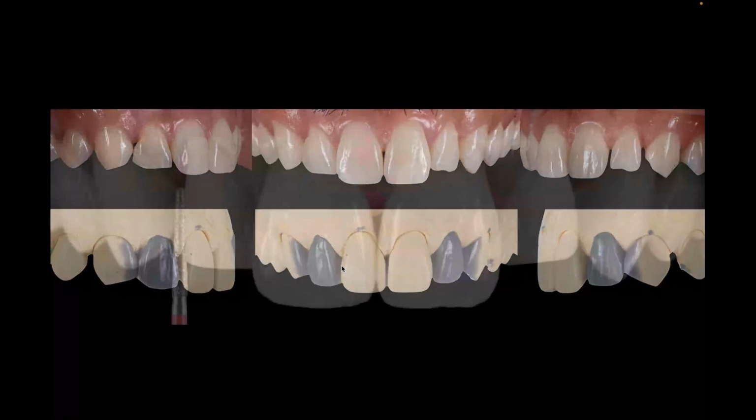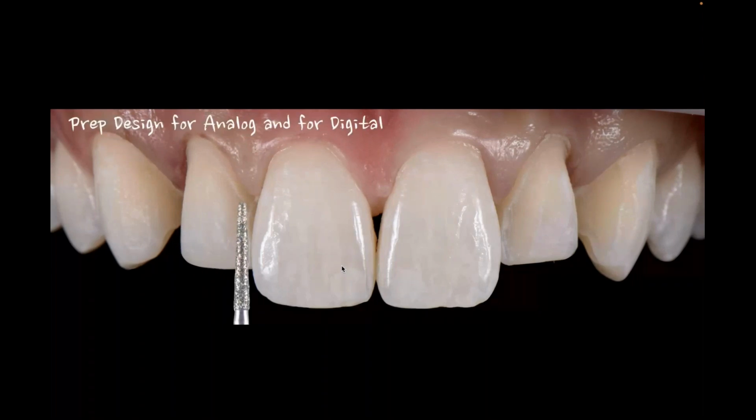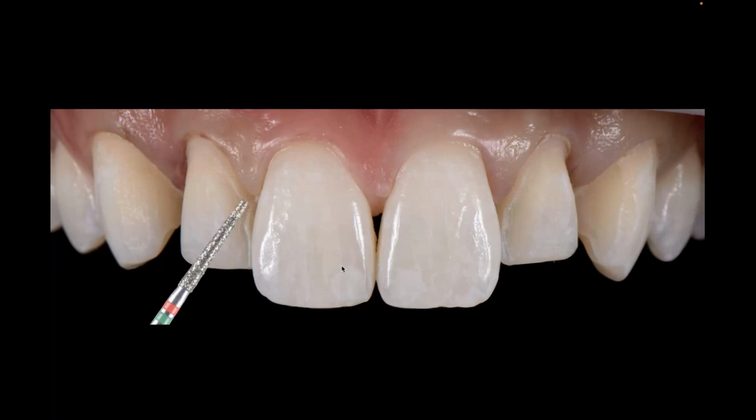So what I actually wound up doing here was, after the preparations were done, a nice chamfer prep and then an elbow prep, which is really critical here for our restorative process. And that critical elbow that we're creating is very important, especially when you're not breaking contacts. So you'll notice here that the contact area is not broken, but yet we've created a deep elbow.